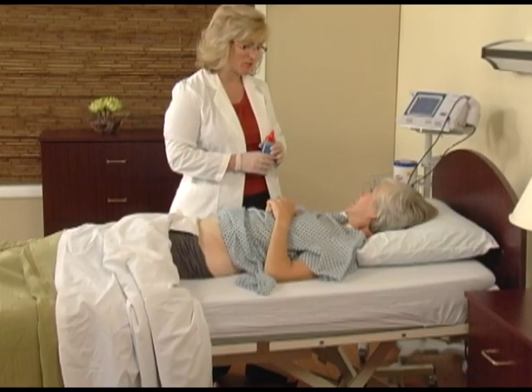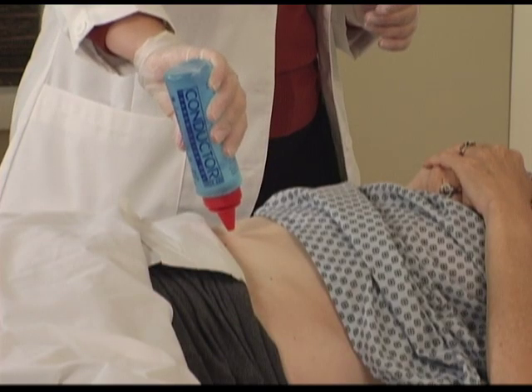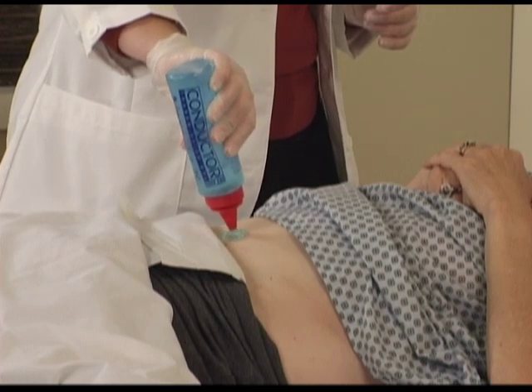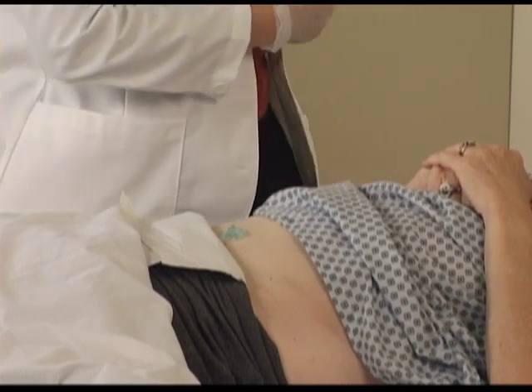Ultrasound gel promotes the conduction of the ultrasound waves. You'll want to use an adequate amount of water-soluble ultrasound gel when conducting the scan. Consider the size of a quarter when applying the gel.